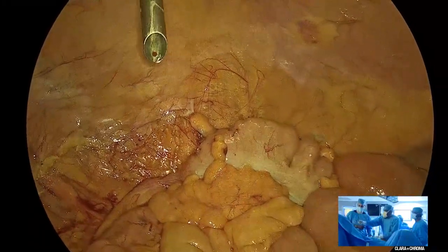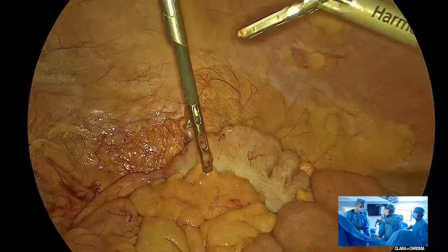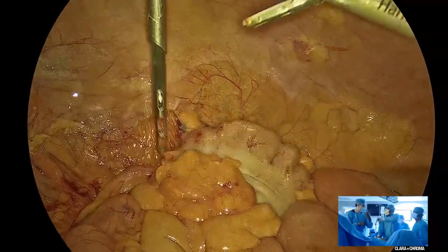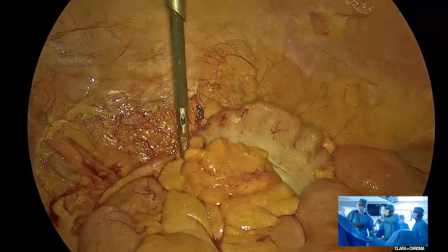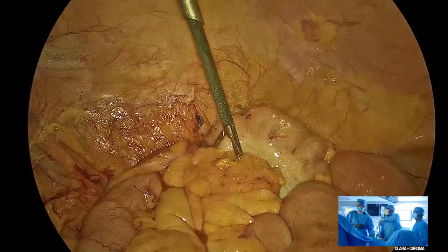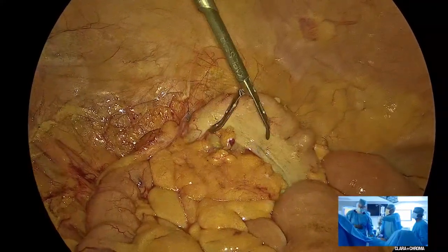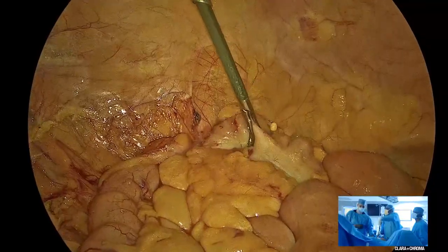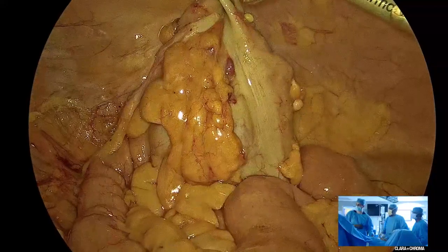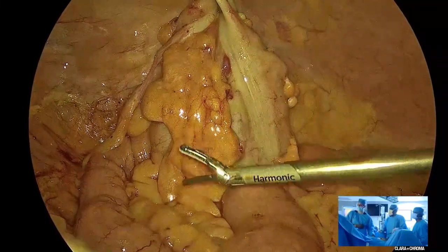Sorry, Ajay, I heard you say something. Yeah, before we start reflecting the lateral, if you pull the ileum, you get the ileocolic being cut. If you pull the ileum, it will all be loose. No, we are actually pulling the cecum, Doctor, laterally. Yes, you're absolutely right. The mark to look for is that ridge, the ileocolic ridge.